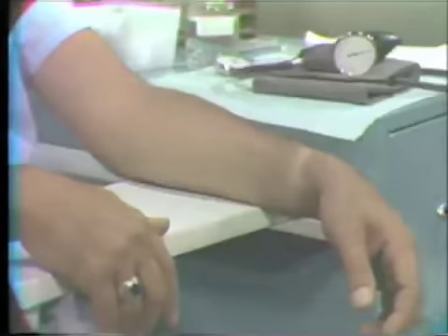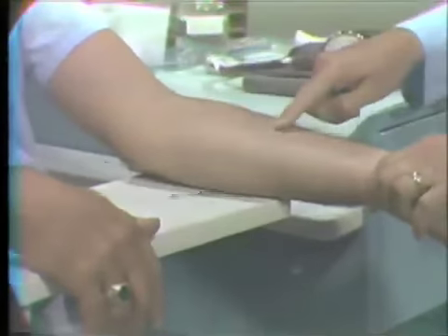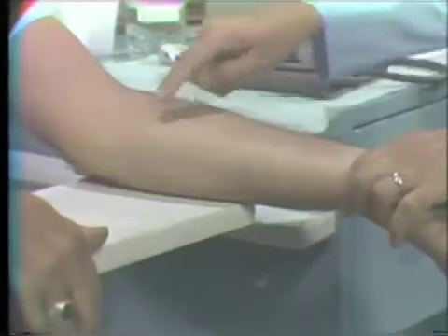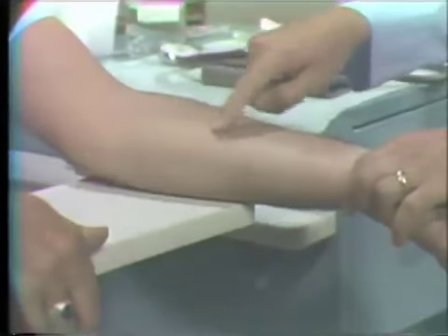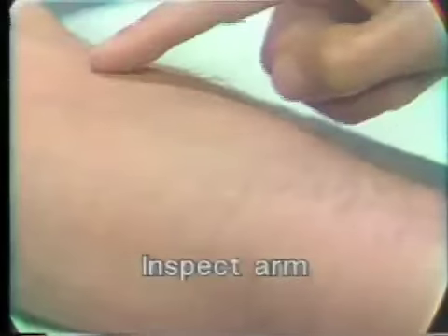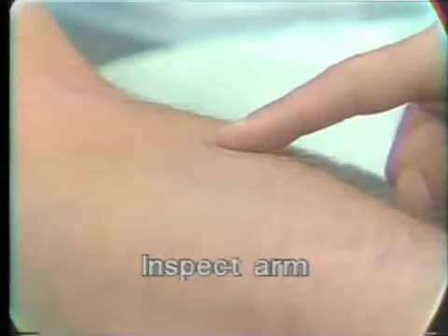Coming to the patient, we'd want to inspect the patient's arm, making sure that when we make the small half-millimeter deep, half-millimeter wide puncture, we do not do it over obvious vascular areas such as this superficial blood vessel. So we'd want to do it in an area off to the side which is free of lesions and free of any erythema reactions which could increase the bleeding. So we select about a 3-centimeter site.